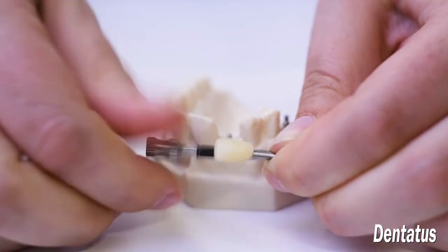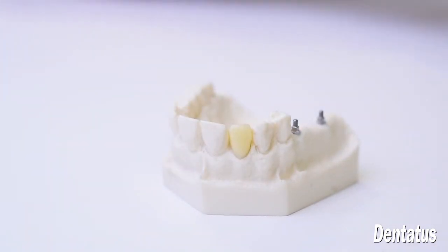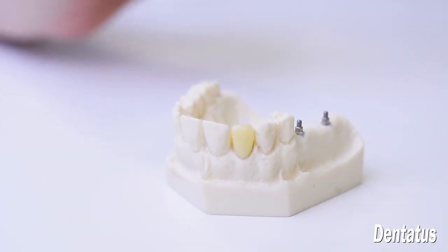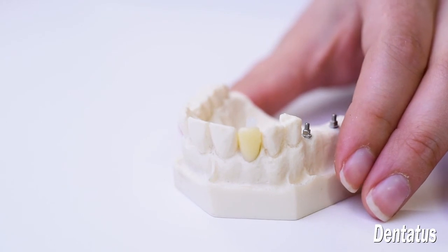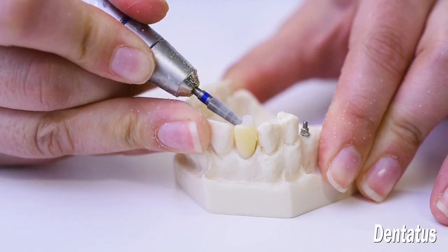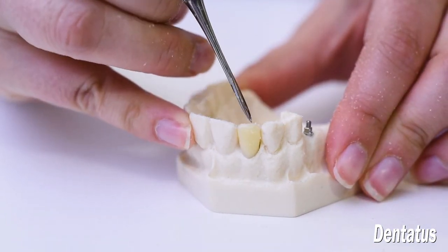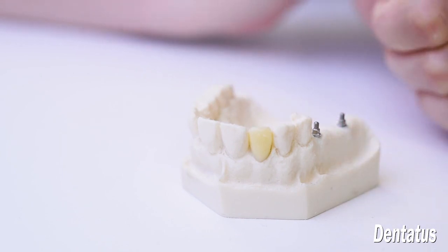Once it's polished, we reseat it in the mouth and use a white screw cap to secure it in place. Take a cotton pellet or implant tape to block out that access hole, then trim down the screw cap to crown level. Then we can fill that access hole with an off-color resin to reaccess it later when we go to take the impression.